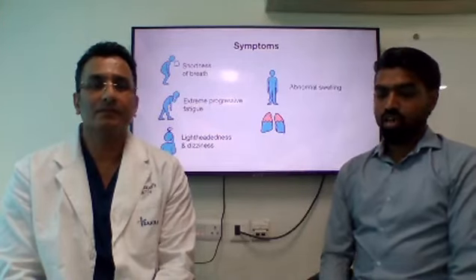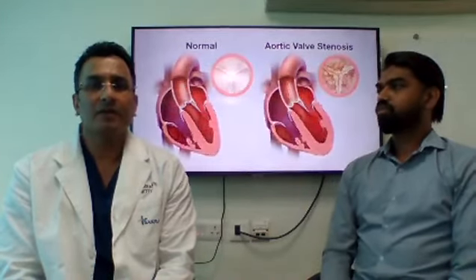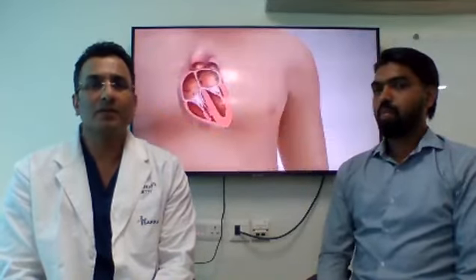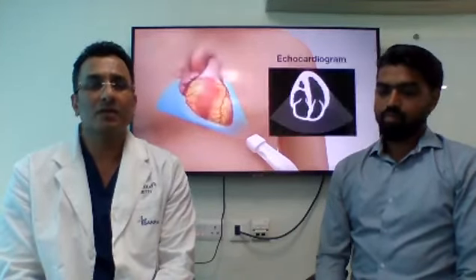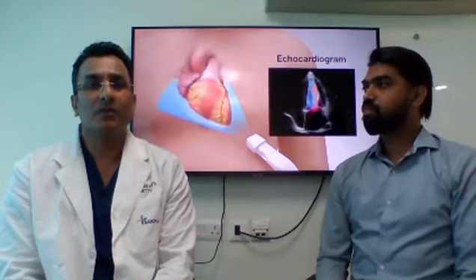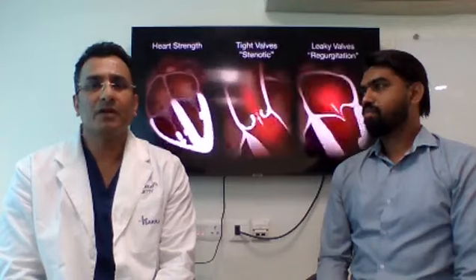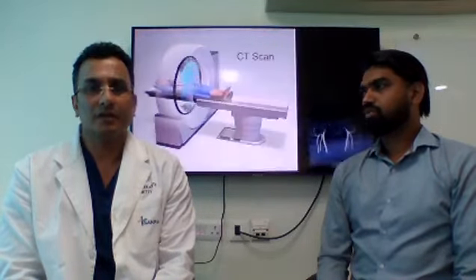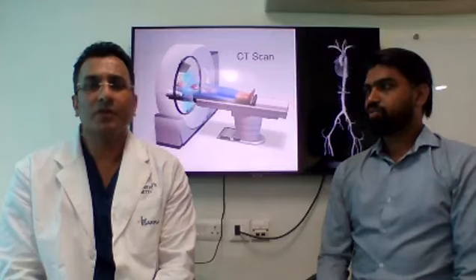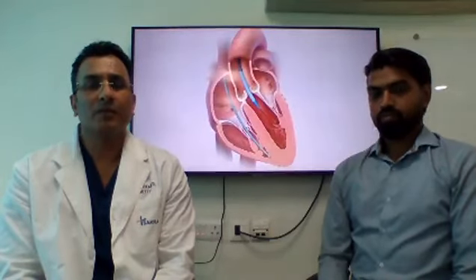So how long do TAVI valves last? The durability of TAVI valves is improving. It depends upon the valve that is used and also on certain conditions of the patient. TAVI has been in vogue for more than 10 years now, so there is good evidence for durability of TAVI beyond 10 years. With further improvement in the technology, you can expect TAVI to become a one procedure in a lifetime procedure.